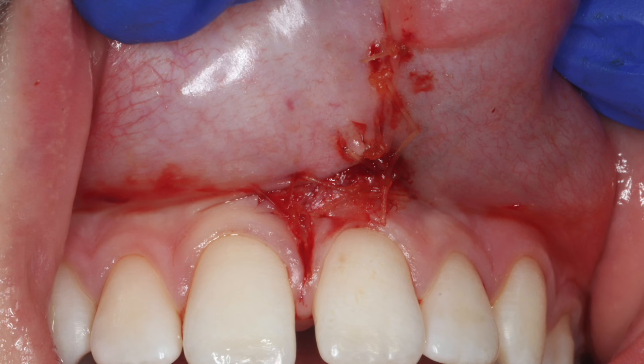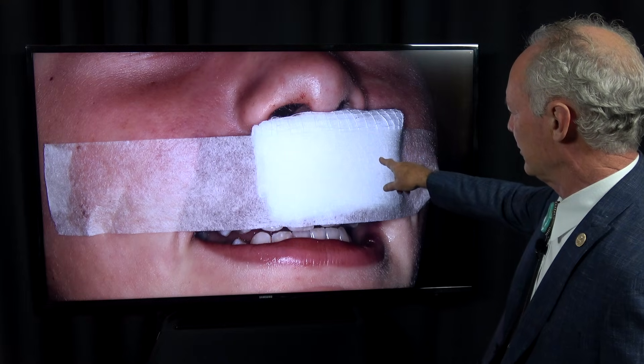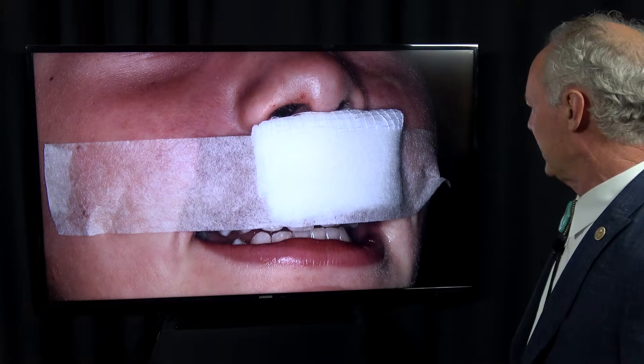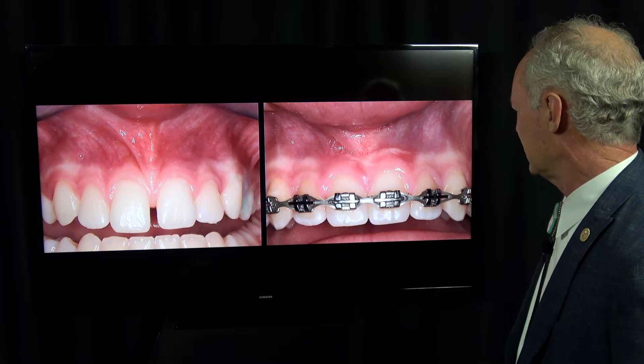I like to put some tape and a couple of 2x2 gauzes on the lip just as a pressure bandage. This is after about three months of healing. You can see it's healed nicely.